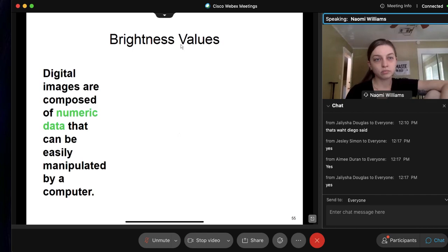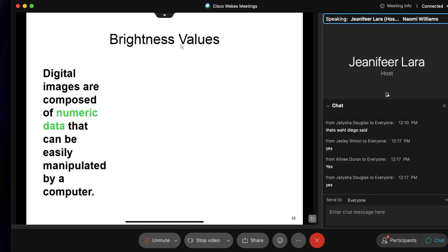Okay. So, how do we express energy of a photon? What are those three little letters again? How is a photon expressed in energy? keV. That's our value. So whether 50 keV landed onto the image receptor, 10 keV landed onto the image receptor, 0 keV landed onto the image receptor, or 100 keV landed onto the image receptor, all of those photon energies are the values that will eventually be assigned a brightness. Make sense? Yes? So transmission, does transmission have a high energy or a low energy? A high energy. Beautiful, because it didn't lose a lot of its energy on its path to the image receptor. What happens to a photon that is absorbed? What kind of numerical value will it be assigned?